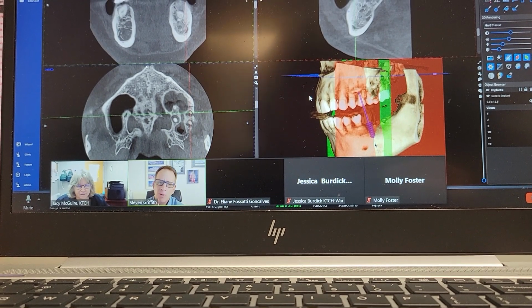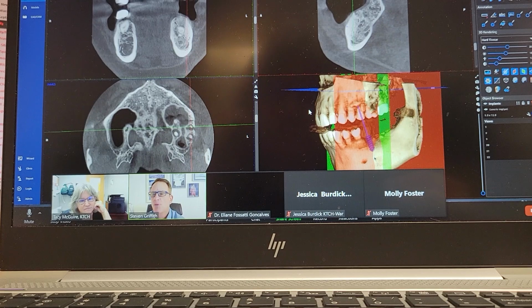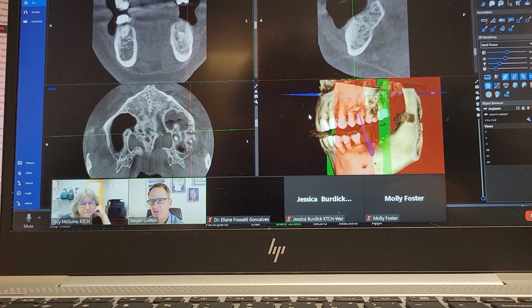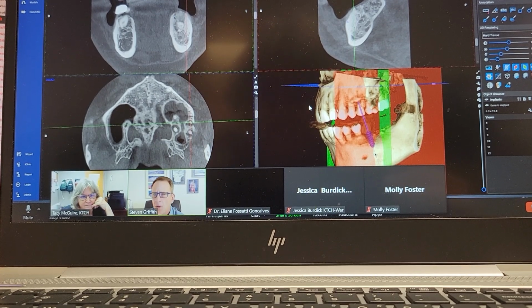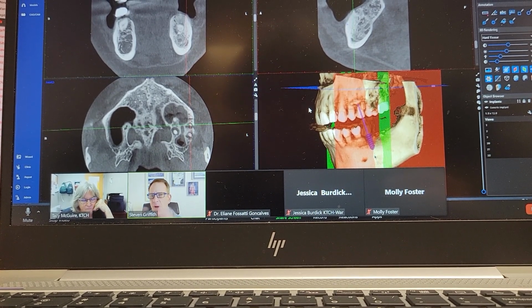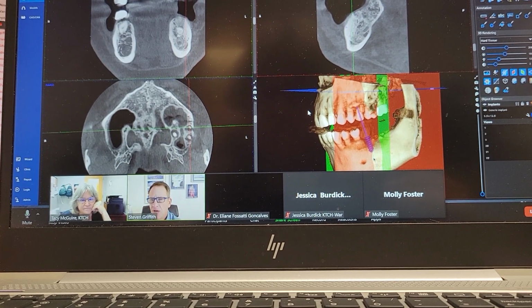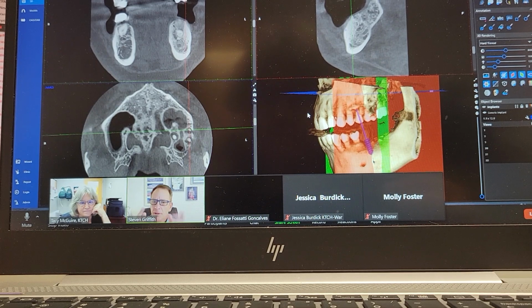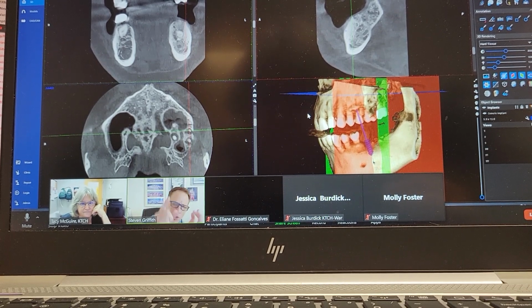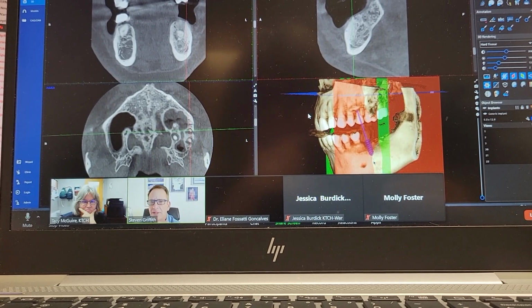Now, why don't I always show that? Because sometimes it's overwhelming to the staff. They're like, oh my gosh, you just showed us how to do a 3D. Now you're telling us to open up the patient's mouth and so on. No, only if you're having an issue. If it's brought to my attention that you're having an issue with that, if you were an orthodontic practice, I'd tell you chances are that patient is squared in the front. Go to that selection, click it, and take that image and see the difference. Because it will make a difference.